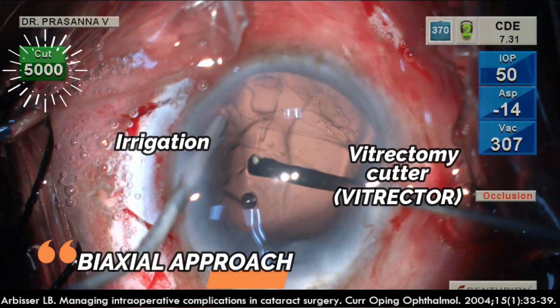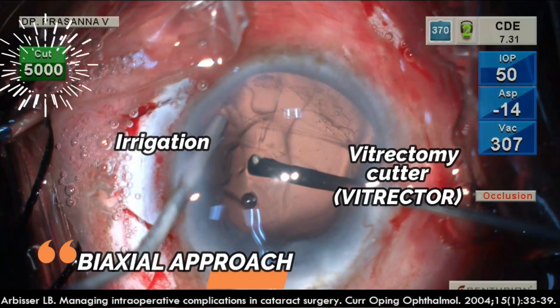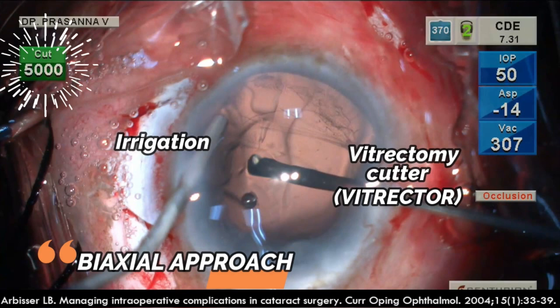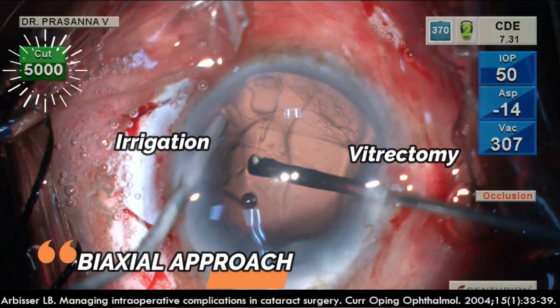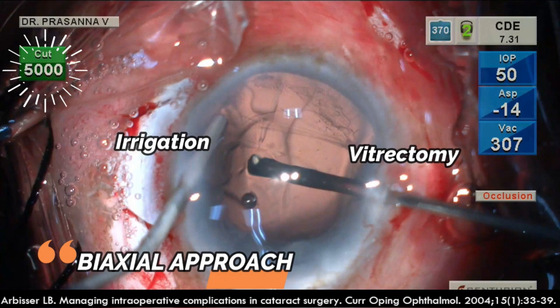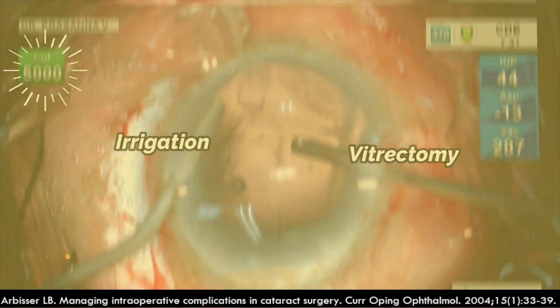It is useful to go through the PCR and complete the vitrectomy. Cut rate should be set to the maximum the machine can offer. The bottle height or IOP should be lowered, and the aspiration flow rate (AFR) should also be kept low. These numbers are not fixed and should be adjusted dynamically based on the stability of the anterior chamber.